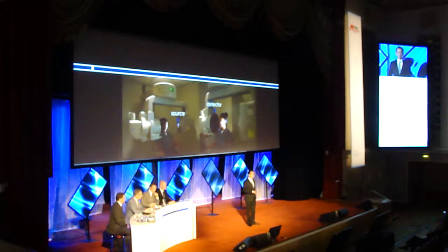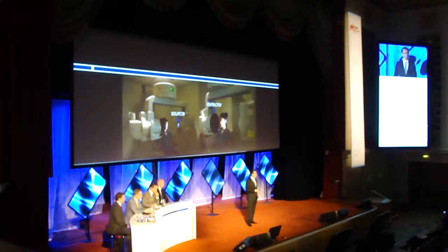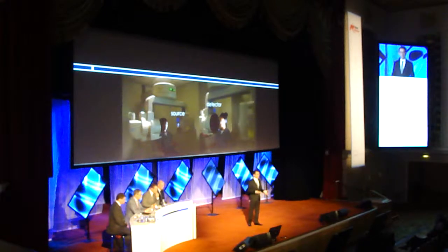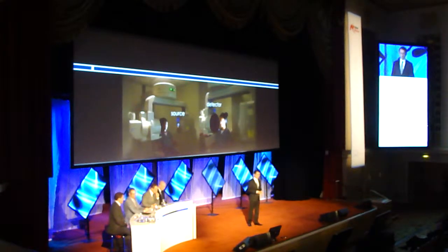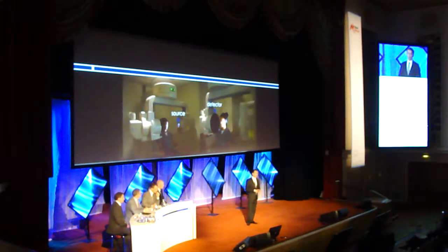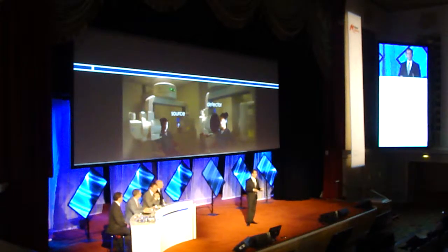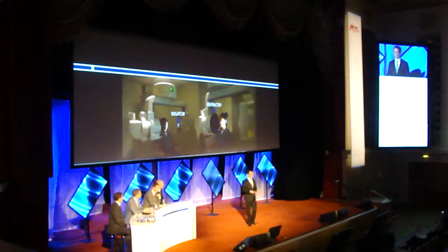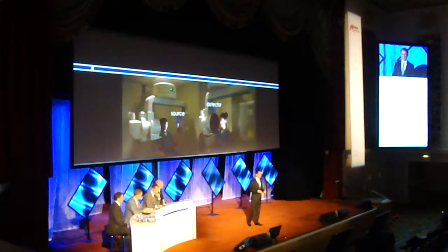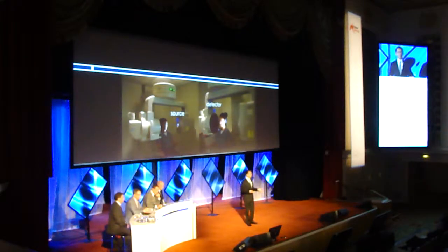Since about the early 2000s, I think cone beam CT has really very nicely incorporated its way into the profession. The earliest of these machines is similar to one of the ones that I've shown here, which are large field craniofacial machines which have fields of view size of upwards of 12 inches in diameter, able to capture an entire human head.